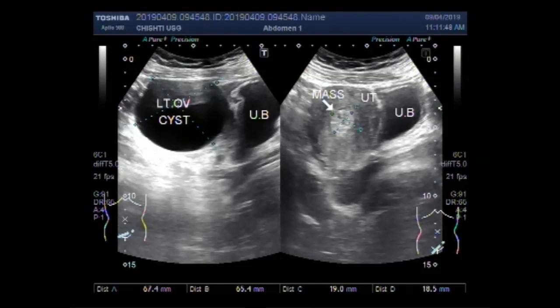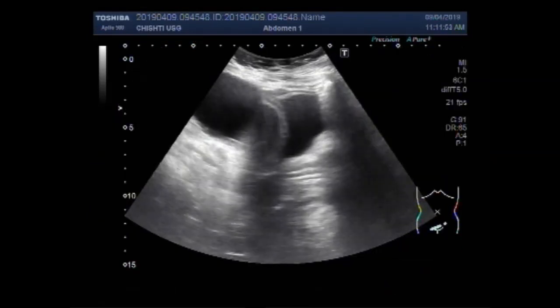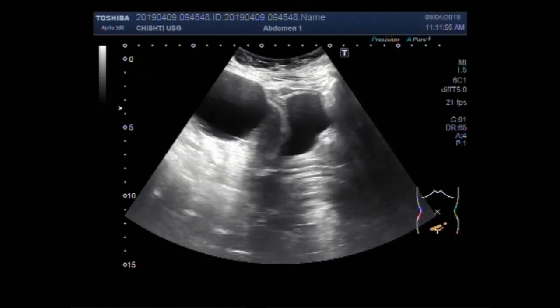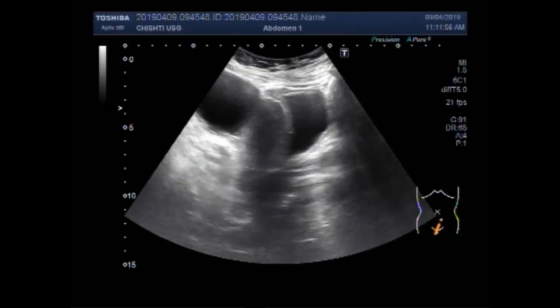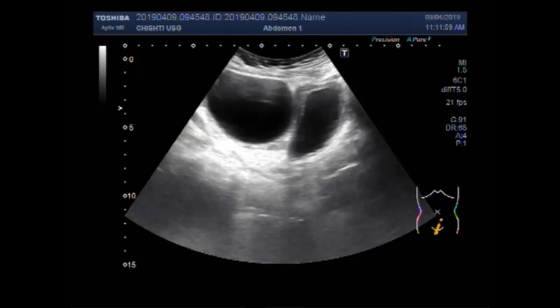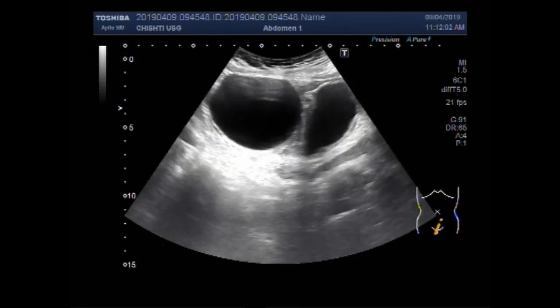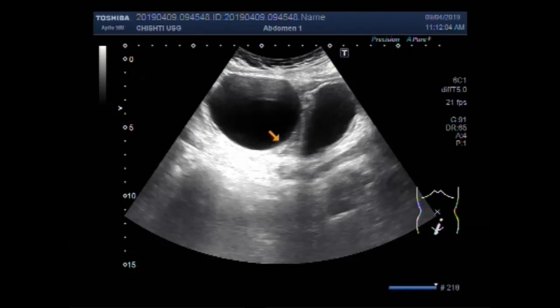Dear viewers, I hope you are all fine. This ultrasound video shows a large ovarian cyst with a uterine mass. You can see the urinary bladder along with the left ovarian cyst — this one is the urinary bladder, and this is the left ovarian cyst.